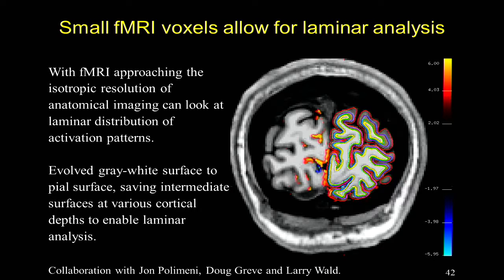One of the fun things happening in MR these days is people have really been pushing the resolution. The physics in general will tell you that you lose signal as the cube of your voxel size. So if you halve your voxels, then your SNR goes down by a factor of 8. That's true for certain types of noise, but it doesn't really apply to the dominant sources of noise in fMRI. And so people have had a lot of success making their voxels significantly smaller without paying as steep a price as they thought.